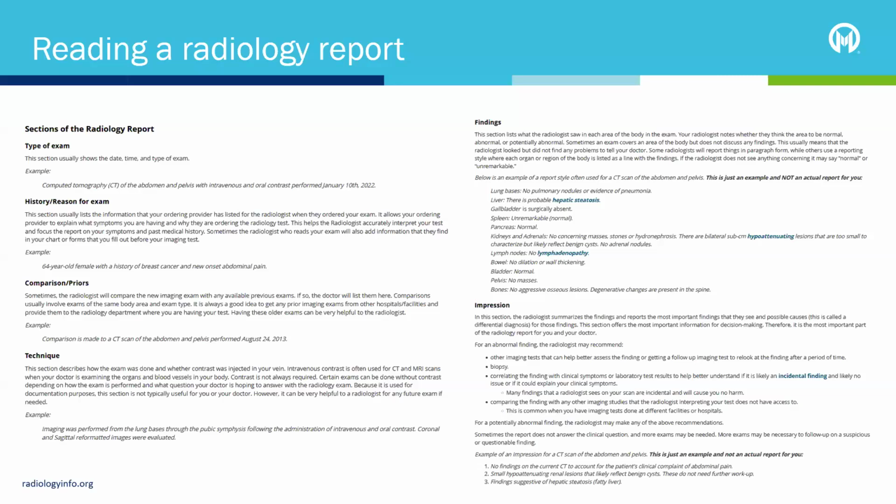Say I'm reading a scan for small bowel neuroendocrine tumor. It's a patient who has known liver metastases, and there's no change. Then I might even say something in my impression like, no change of liver lesions and nothing new concerning. Unfortunately, that's kind of a garbage term, medical jargon or lingo. You're reading the scan, you're like, oh, liver lesions are stable. You're like, okay. What that means, right? But a layperson could say that lesions, there was tumor.